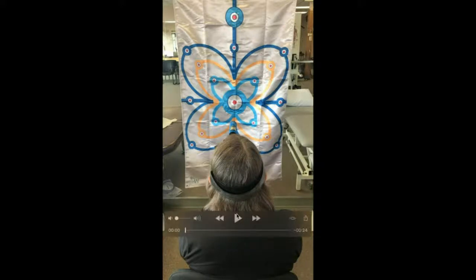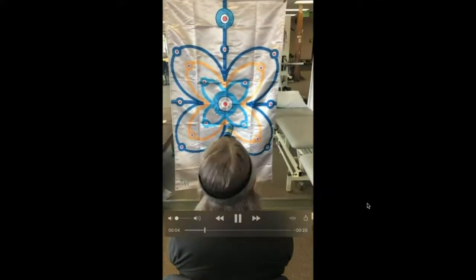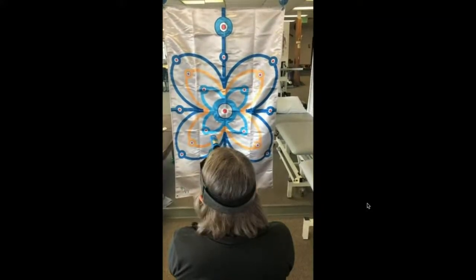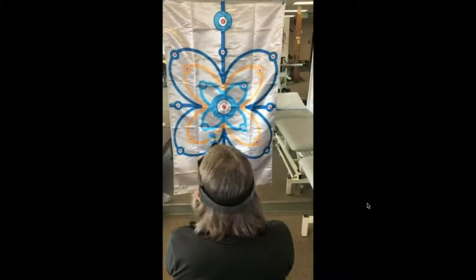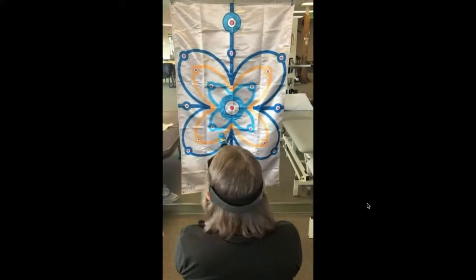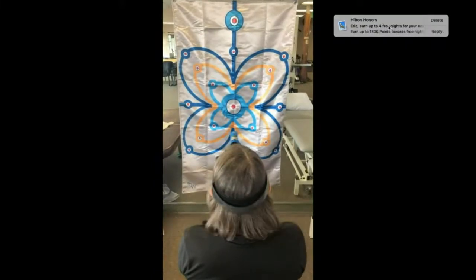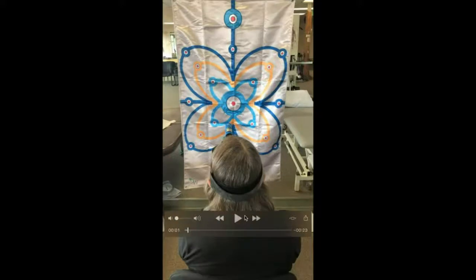So as we watch this laser move again, she tries to go back and forth equally. She goes off the flag to the left, more dominant to the left. Can't go to the right as well. She's all over the flag, up and down. Okay, it's bouncing around. And these are things that oftentimes, just with the naked eye, you have a hard time looking at and distinguishing in the clinic, right? Unless you have a video representation of what's going on with the head. So let's watch that one more time so everybody can see that, okay?